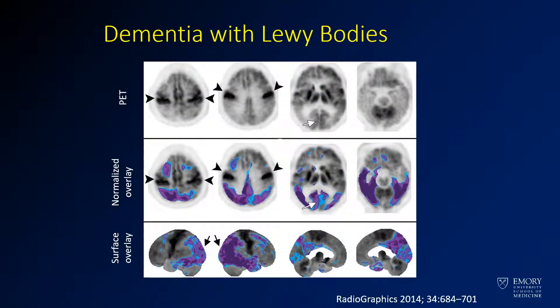In Lewy body dementia, you see areas sparing between the frontal and parietal lobes with involvement of the frontal, parietal, and occipital cortex. The normalized overlay shows involvement of the occipital lobes. Lewy body dementia is one of the only dementias to involve the occipital lobes. There is a form of Alzheimer's which also involves the occipital lobes, but that would be less common.